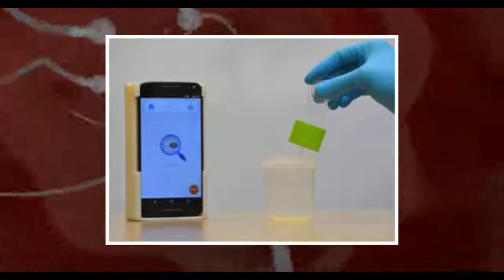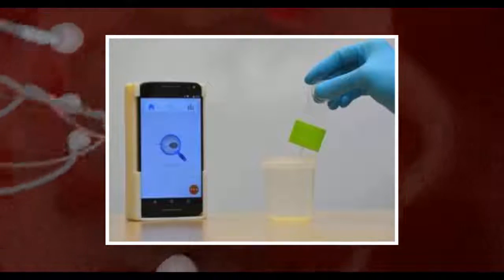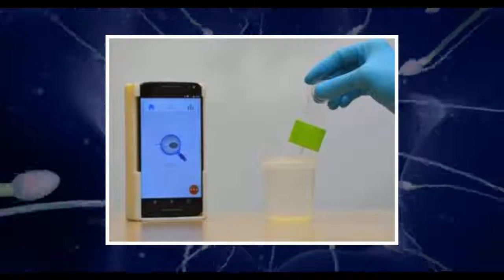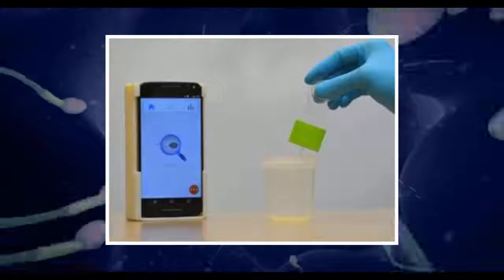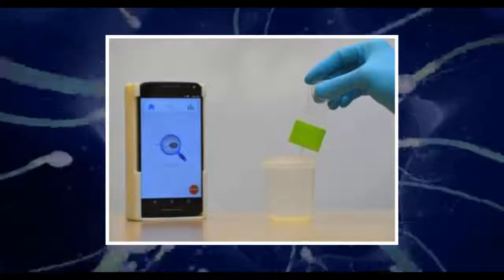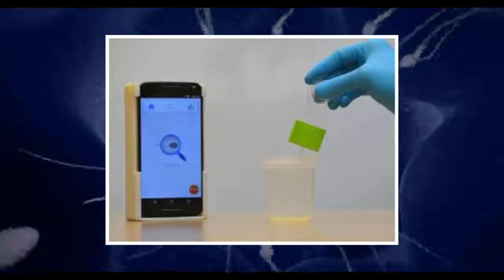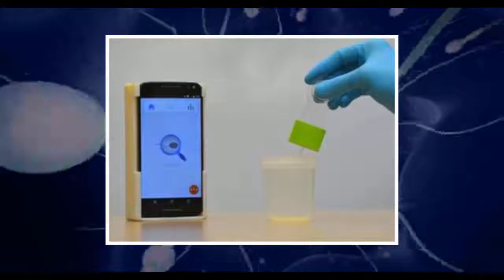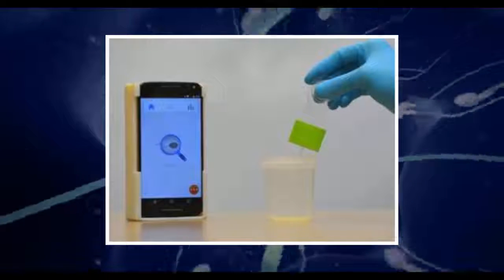While it's not the only at-home testing product of its kind, it's the first to analyze both sperm concentration and how well the cells can move, which are critical to getting a fuller picture of fertility. The study's results show that the device can identify abnormal semen samples with 98% accuracy compared to traditional testing methods, which use bulky microscopes and require highly trained technicians.